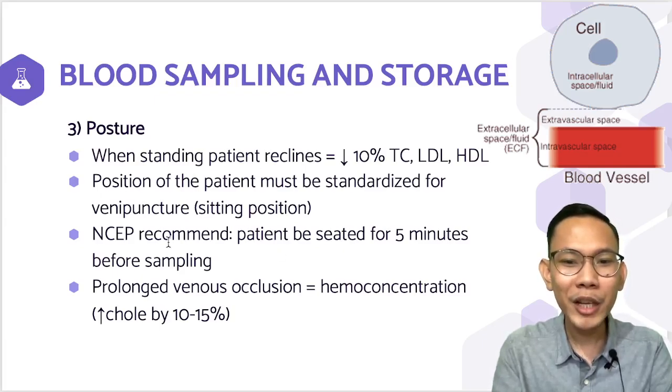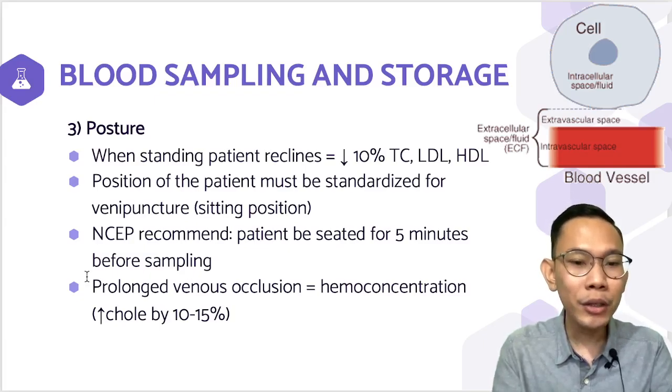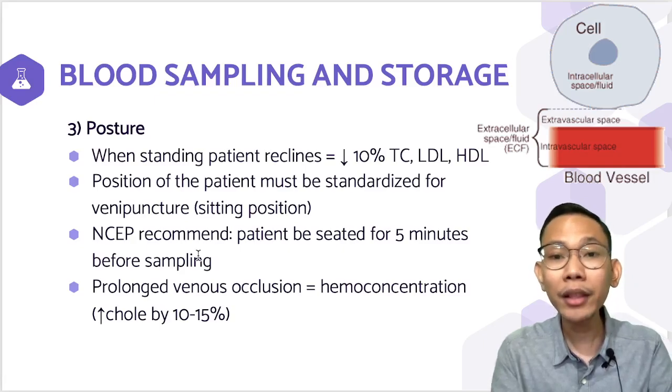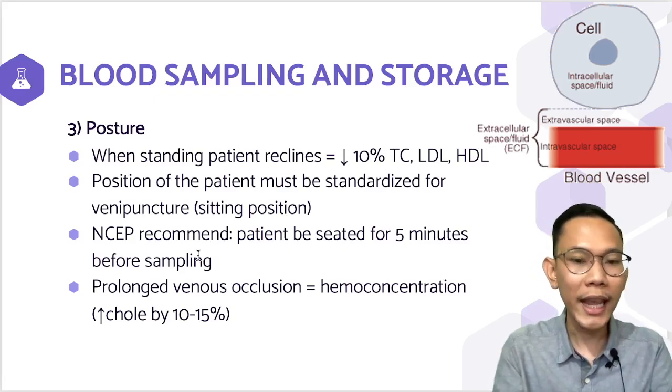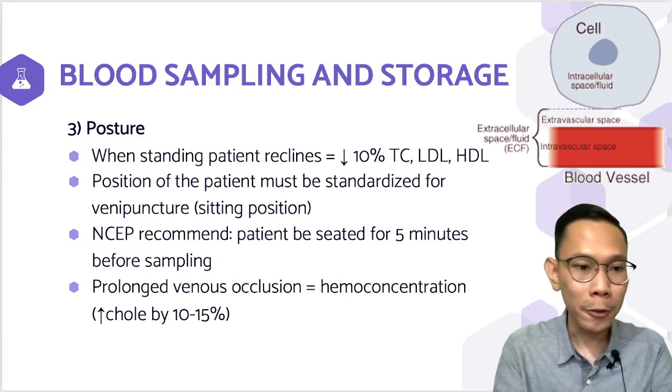NCEP recommends the patient be seated for 5 minutes before sampling, and remember, prolonged venous occlusion or hemoconcentration may increase your cholesterol by 10 to 15%. Again, to avoid such problem, we have to follow the standard way of collecting your sample.